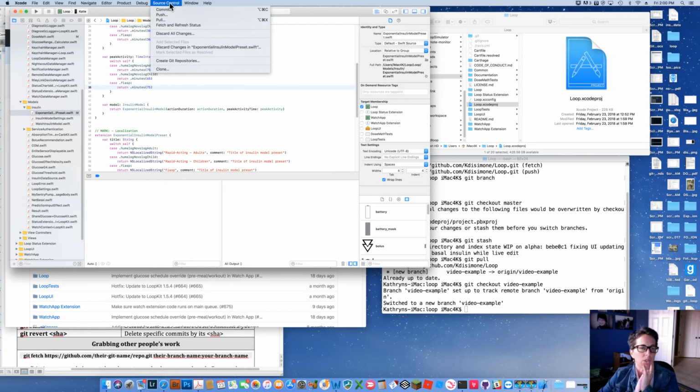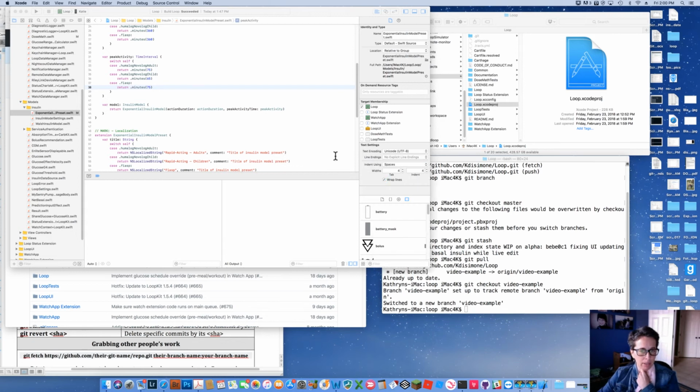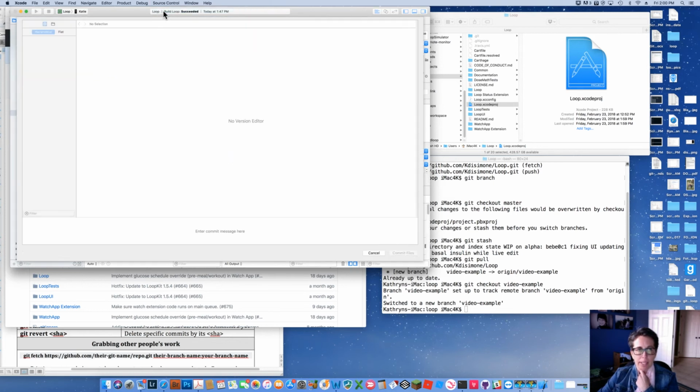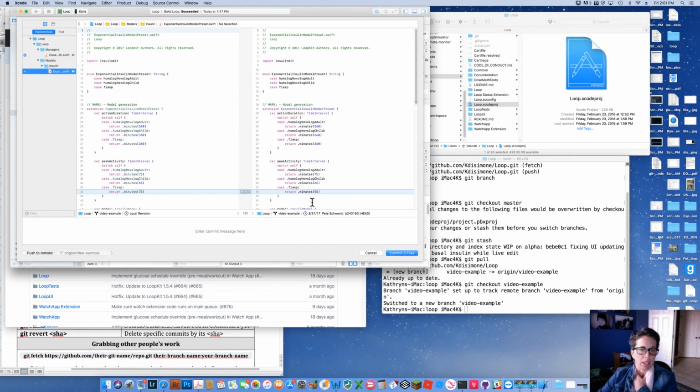So I can go up to source control. The cool thing is, Git commands that you typically do in your terminal, a lot of those same Git commands are actually written into Xcode to be a little easier. You can go up to source control, commit, and you can say, look, there's the two files I changed. If you click on the file, you can see exactly what was changed. On the right is the original, on the left is what I changed. And same here, on the right is the original, on the left is how I changed it.